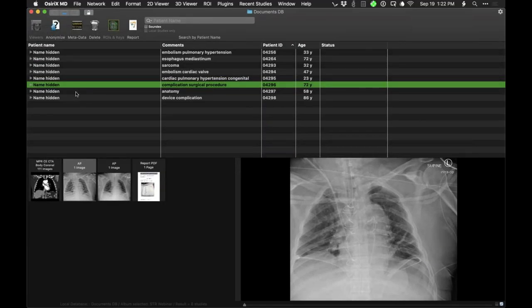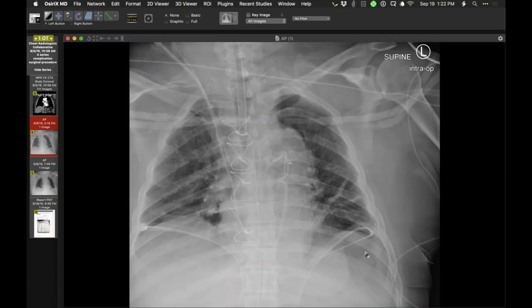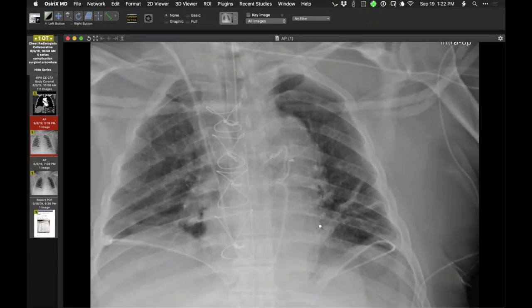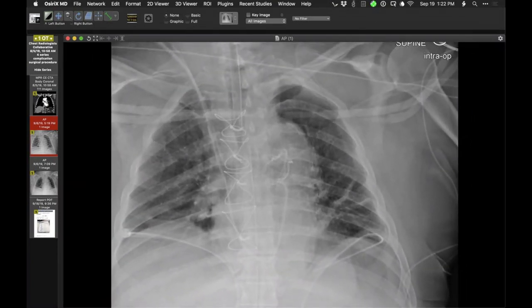Howard, I think one point about those is I've seen a case years and years ago where it mimicked a sternal wire. Because it's kind of twist tied, and it was in the midline with the wires. So right in the middle, you might not see it. And sometimes there are these external wires from the various pacing devices and stuff. So you have to always have a high index of suspicion. It's such a rare occurrence these days. But in this case, their sponge counts were off, so they were really suspicious of a retained sponge, and we just confirmed that at a glance.